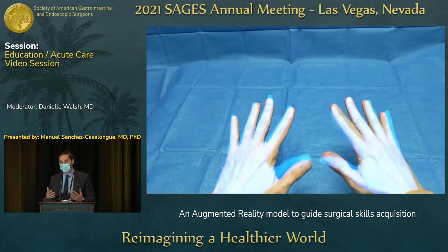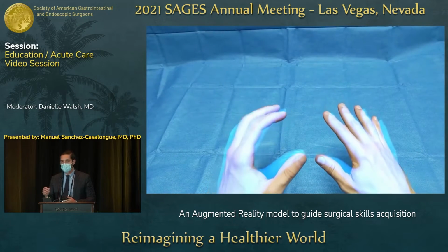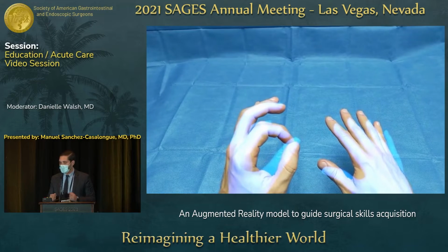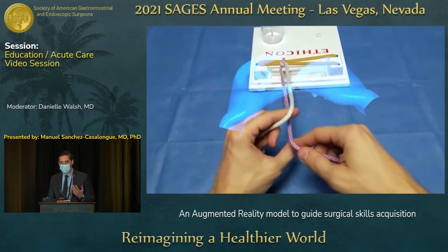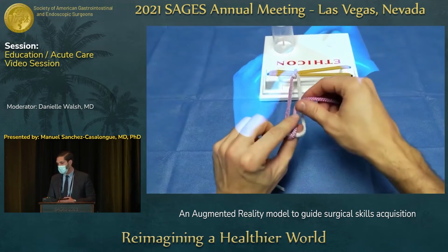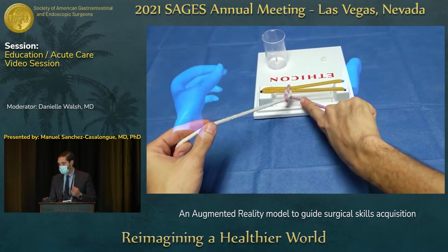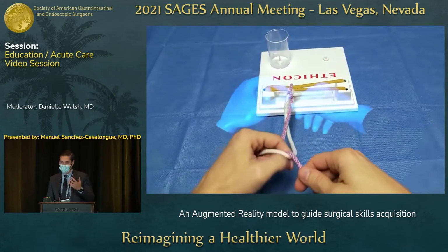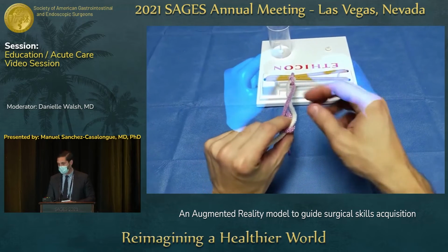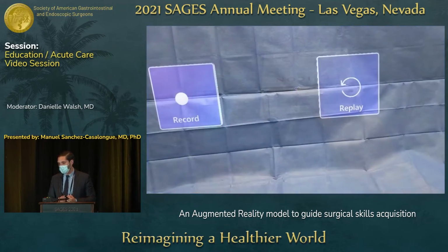This is what's seen through a Microsoft HoloLens 2 device. So you can see my hands there. And in light blue, you can see an overlay of the hands and how it tracks really accurately. Same thing if I'm doing a two-hand knot tie in one of the traditional kits. You can see that in light blue, you see what the system is reading as my hand, finger, and joint positioning, and it's very faithful, and it looks even better when you have this helmet on. So again, just showing a straightforward two-handed knot tie.